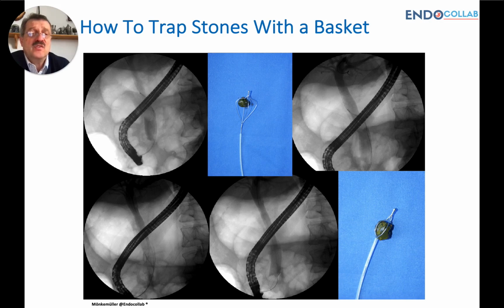So the first maneuver is to push against the stone. The second maneuver is by pulling and trapping the stone. And the third key maneuver to entrap stones is the parallel basket opening technique, where you are right next to the stone, you open and trap the stones.